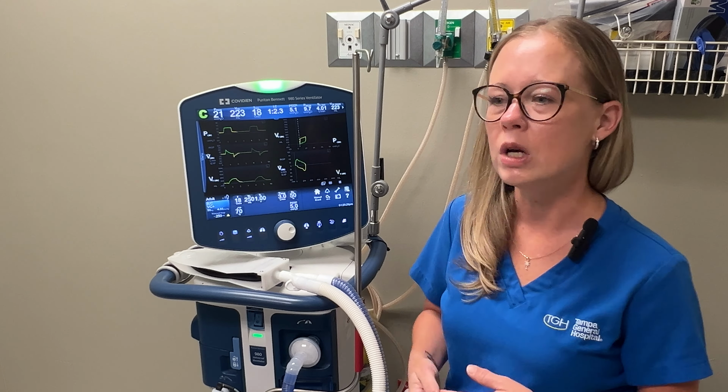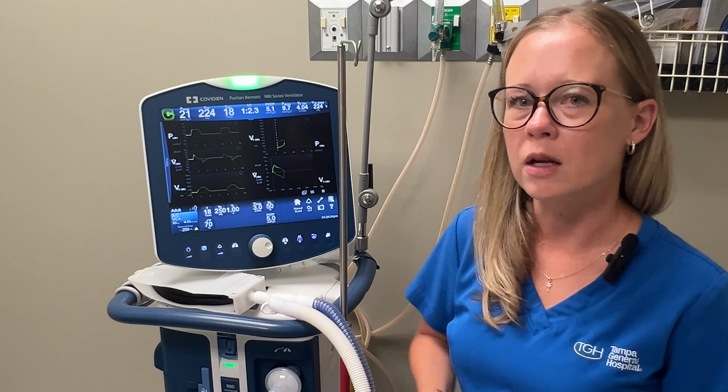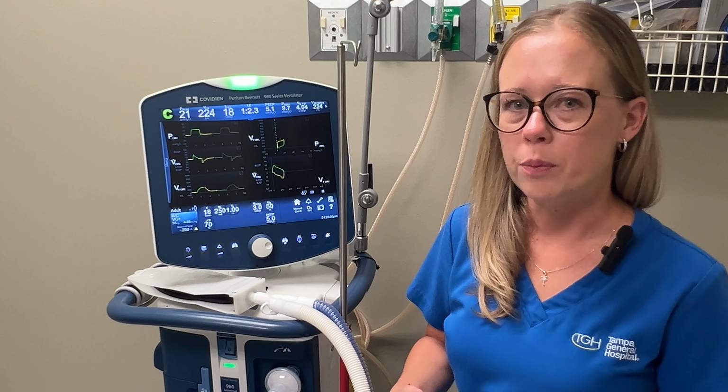These waveforms right here, this is the pressure waveform, this is the flow waveform, and this is the volume waveform. These waveforms can give us a lot of really good information when it comes to caring properly for the patient. On this waveform, if this line is not returning to this line, which is what we call baseline, if it dropped below baseline, that would indicate auto PEEP in the patient.